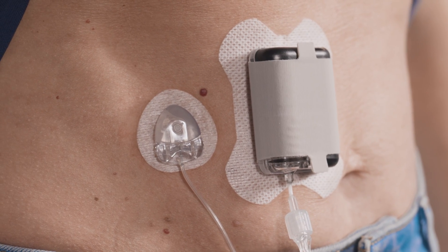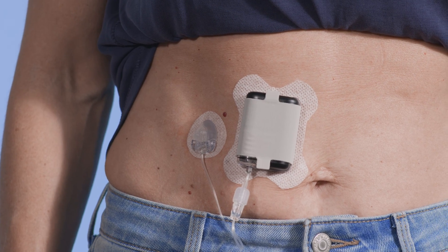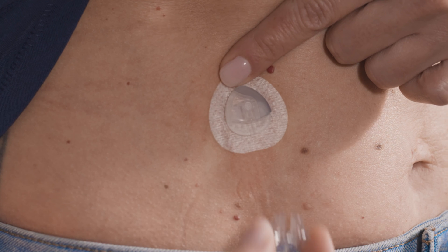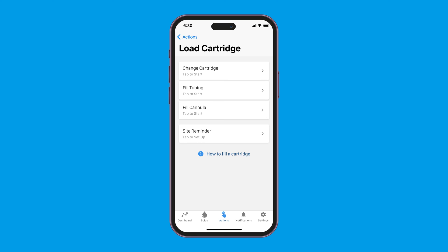Remember that changes in temperature or weather can cause bubbles. If you find bubbles in your cartridge, consider wearing the pump with the tubing angled down or to the side to help prevent the air from getting into the tubing. If you see air bubbles in the tubing, disconnect the infusion site from your body. Then under the load cartridge menu, select fill tubing — this will push the air out of the tubing.